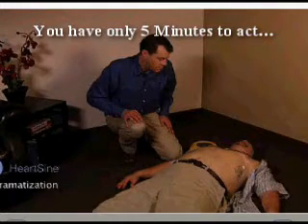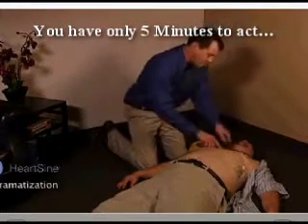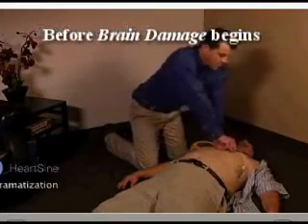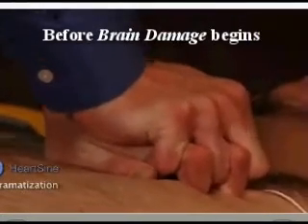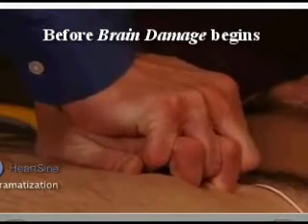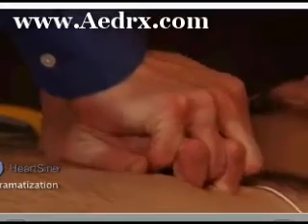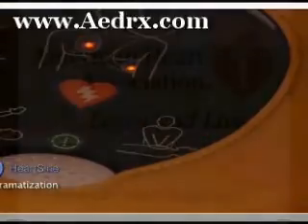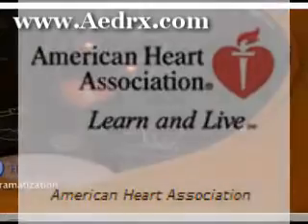It is safe to touch the patient. Begin CPR. It's important to apply effective CPR chest compressions for two minutes as directed. A metronome helps coach you at the American Heart Association's recommended chest compression rate of 100 compressions per minute.